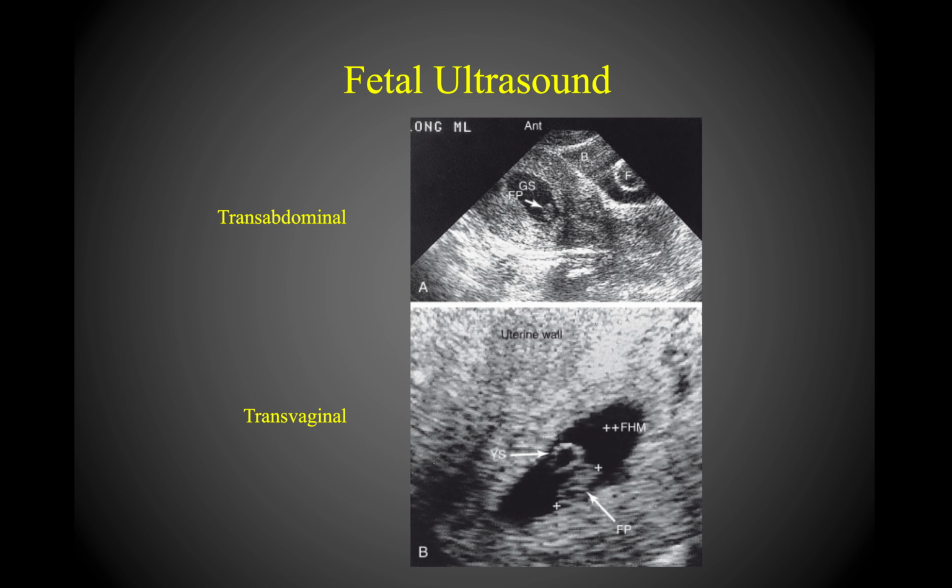Oftentimes they don't know if they're pregnant, at least in the early stages of pregnancy, and so if you irradiate a fetus with that much radiation early on, there's a very high risk of causing significant issues for that developing fetus. And so as a result, we try to stay away as much as we can from X-ray and other modalities that are going to expose a female to that radiation. So ultrasound then is our modality of choice. It's cheap and accessible, and you can appreciate the pelvic viscera quite well in ultrasound.